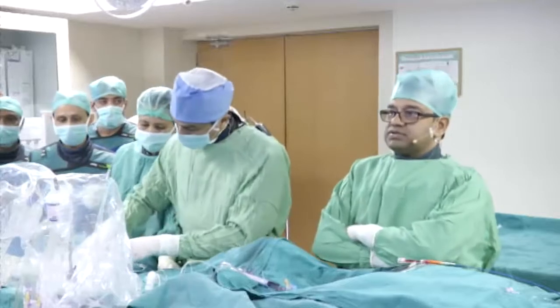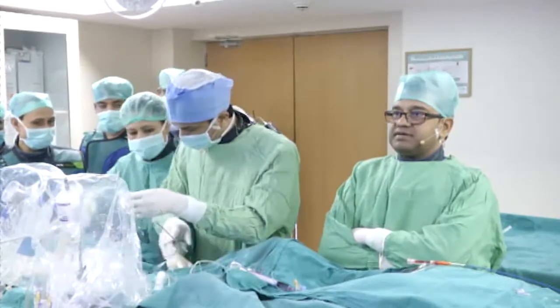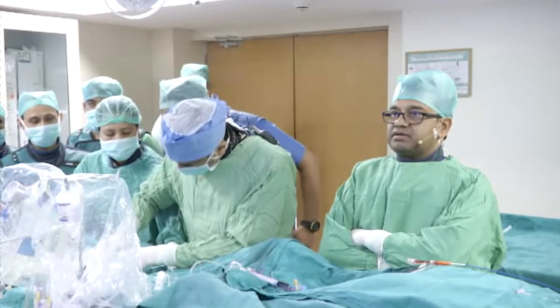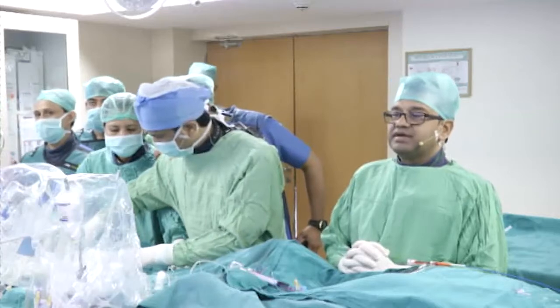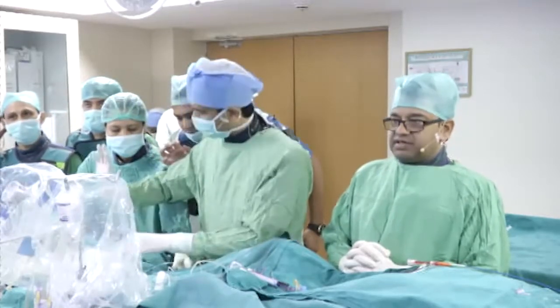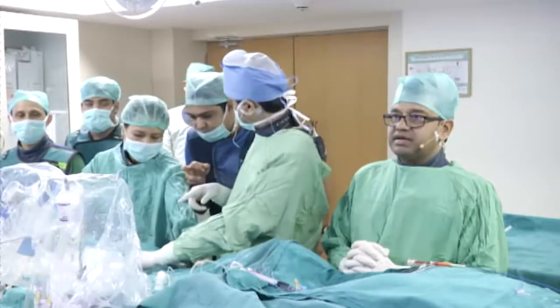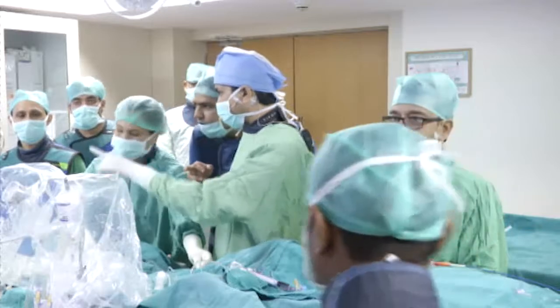We have a case here, a 70 year old lady whom we had done angioplasty and stenting of LAD in 2007, and she had recurrence of angina, and her stress echo was positive in inferobasal area and anterior wall. So we had done her cardiac catheterization.